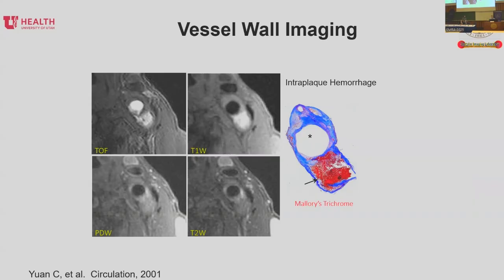But what is interesting is up to now that even though these images are about 20 years old, I think that the image quality of this are still pretty comparable of what we can do now. And the other thing is, even though this provides a lot of information, it's still not in real clinical practice. It's still limited in centers who are doing research and other places who have particular interest in looking at the vasculatures.